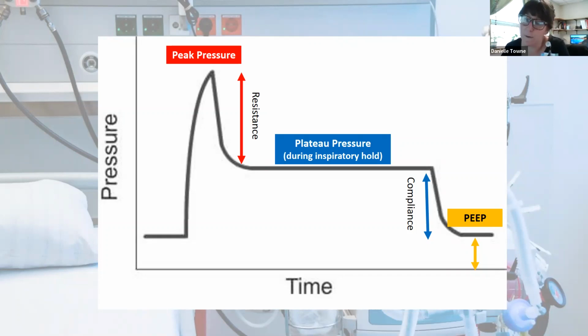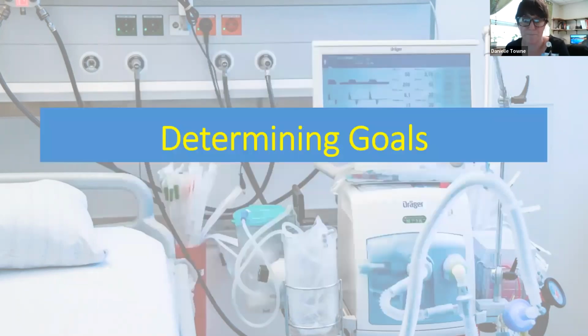You add in more PEEP to that ventilator setting, and now you're actually increasing our overall peak pressures because your PEEP is higher, and all of these accumulate and add together. So these can be some confusing topics if you don't actually get to see it on a patient on a vent. I would definitely recommend looking into it a little bit more so you can read more about these and ways that you can mitigate having these numbers be too high, because there's a lot of really interesting literature out there about this. But it is a good concept to be able to understand.